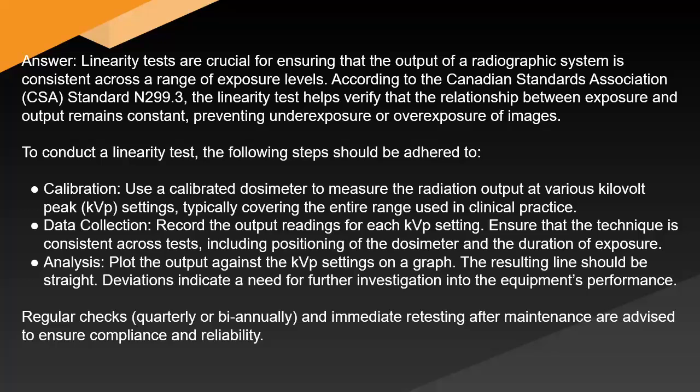Analysis. Plot the output against the kVp settings on a graph. The resulting line should be straight. Deviations indicate a need for further investigation into the equipment's performance. Regular checks, quarterly or biannually, and immediate retesting after maintenance are advised to ensure compliance and reliability.